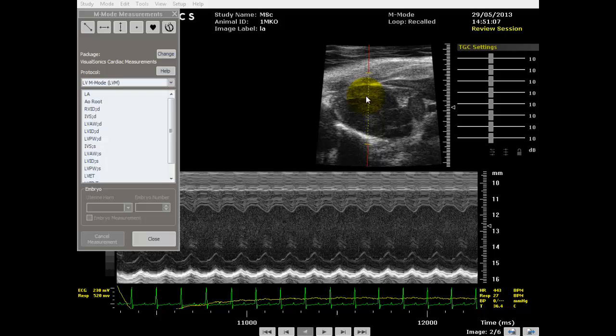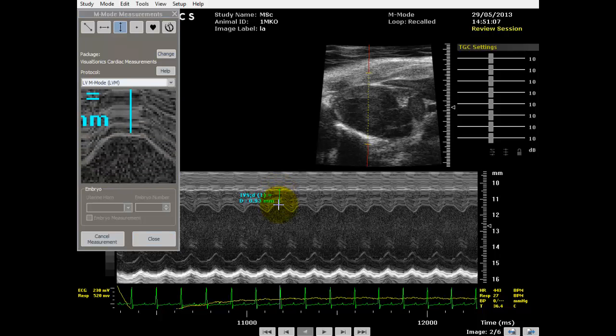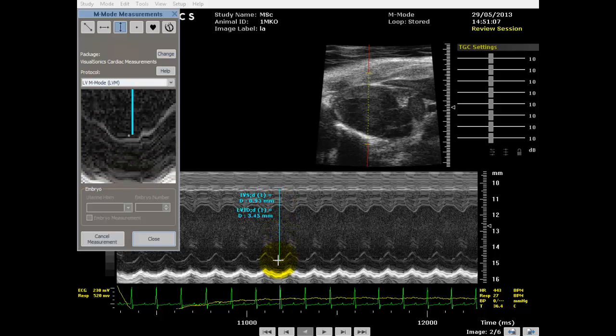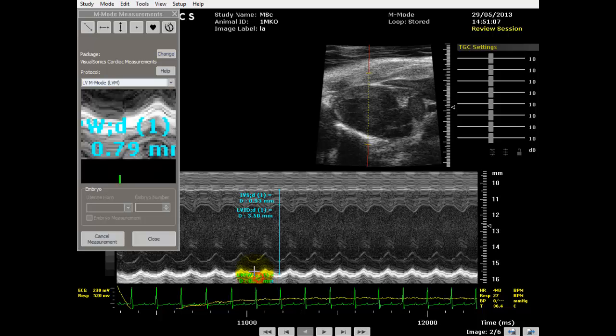It's the same oblique angle we'll be taking in all of the animals that we measure using this method. So I'm going to choose up here IVS, which is interventricular septum at diastole. Choose a point, find the outside wall, click, drag, and then click again, and then automatically the software will determine we're going to measure internal dimensions, so we can then move back down to the endocardium on the inside here, click done, and we can move down to the edge of the heart and click again.